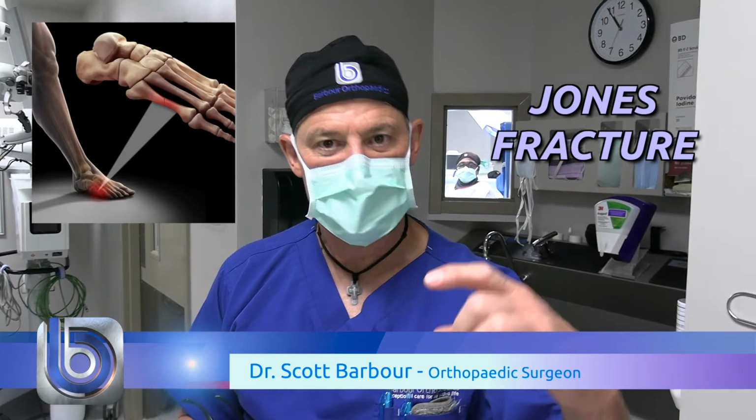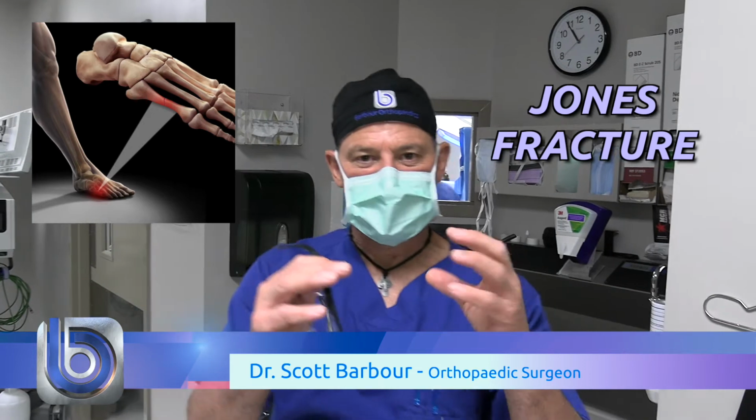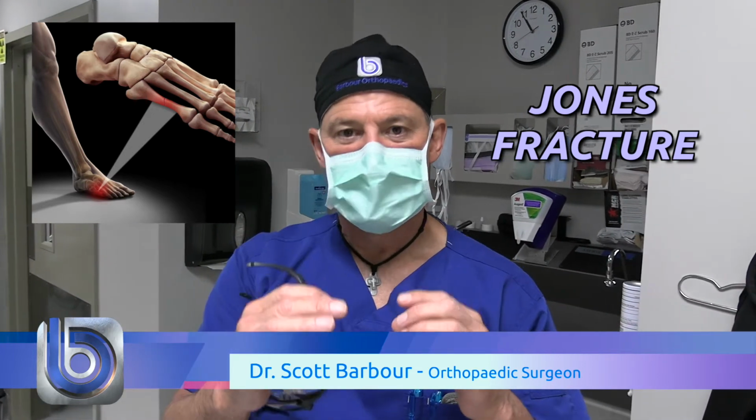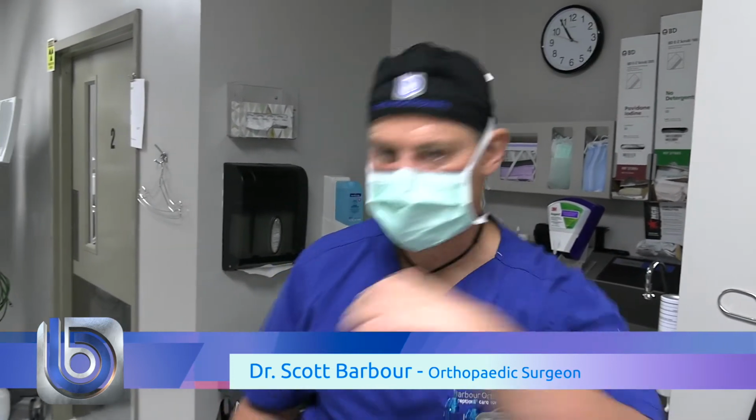Hi everybody, we're getting ready to fix a Jones fracture, which is a broken bone at the base of the fifth metatarsal, your pinky toe metatarsal, right at the base on the outside of your foot. This bone breaks, and because of the poor blood supply, it tends to not heal. So we're going to make a tiny little incision, insert a little screw to get some compression at the break site and promote healing. Let's go in and take a look.